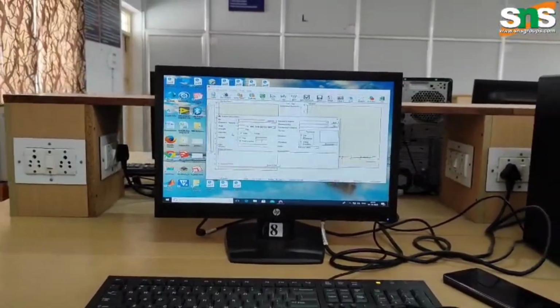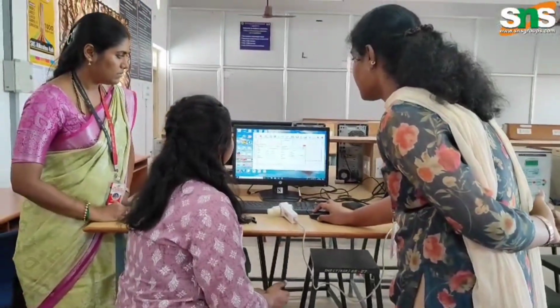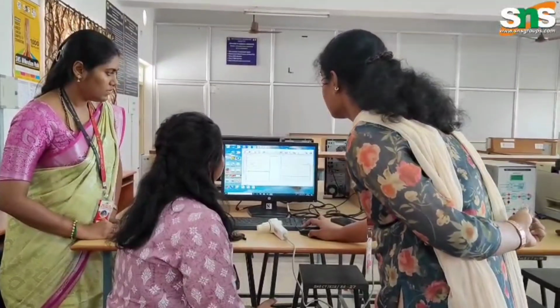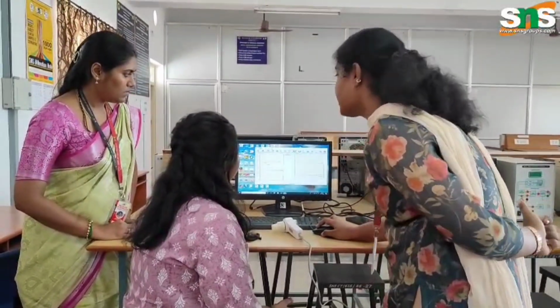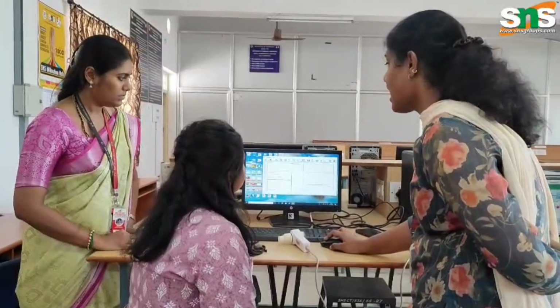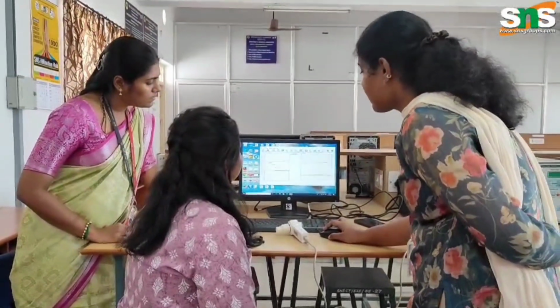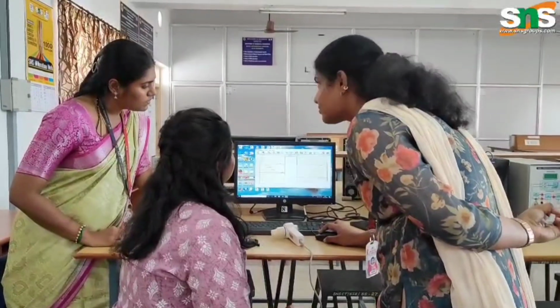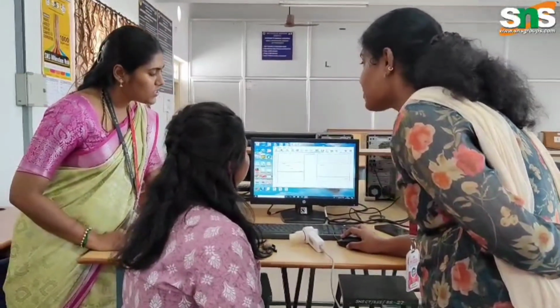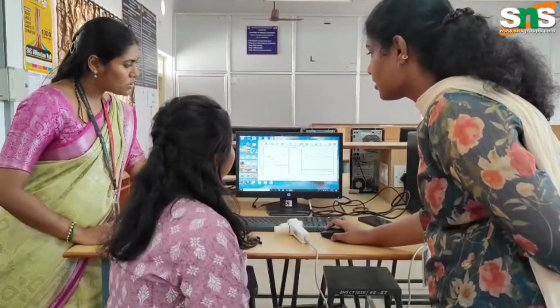It is used to analyze our breathing test, whether it is obstructive, restrictive or normal. We have tests like FVC, which is forced vital capacity, SVC, the slow vital capacity, and MVV, the maximum voluntary ventilation. Now we will see FVC, that is forced vital capacity.